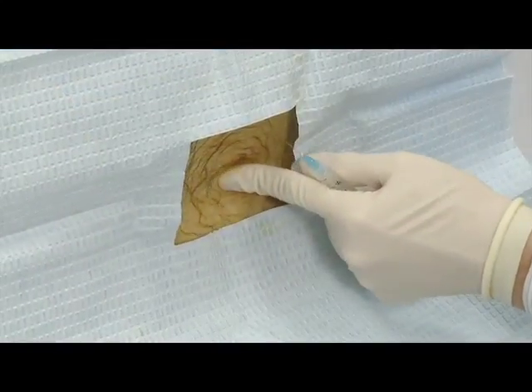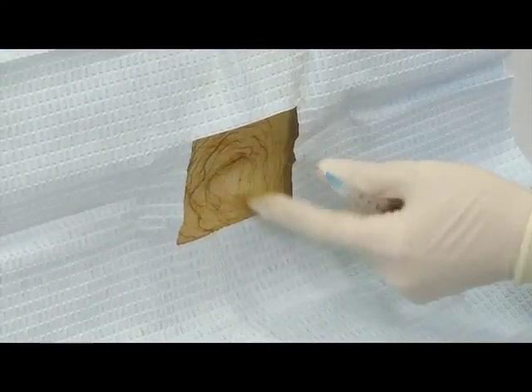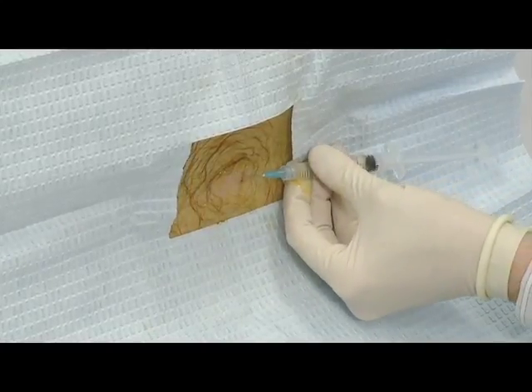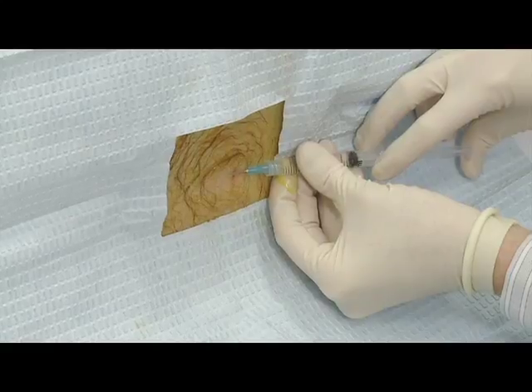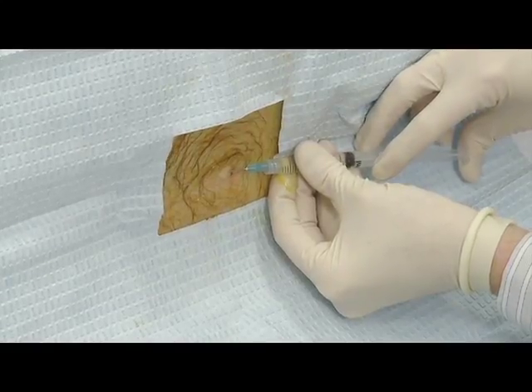For local anesthesia, inject lidocaine at the needle insertion site. Inject about 1 cc of lidocaine superficially with a small needle, 25 gauge, to create a wheal.